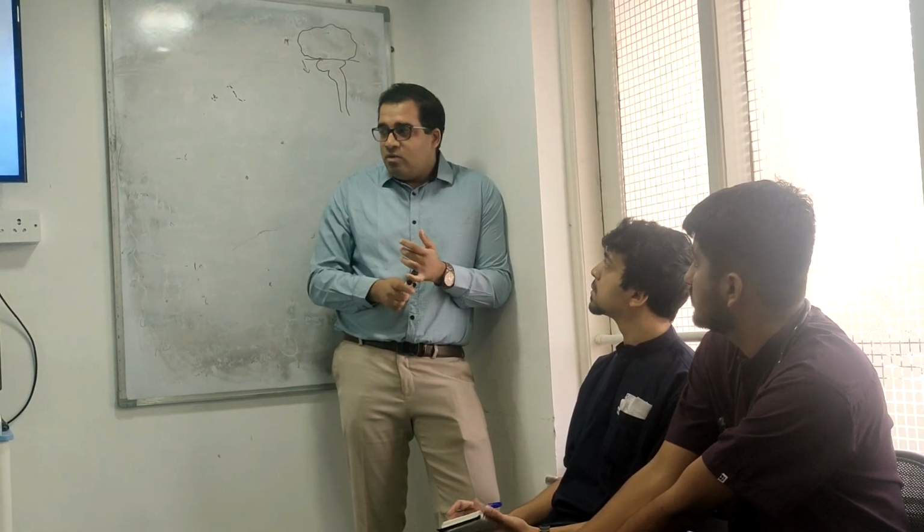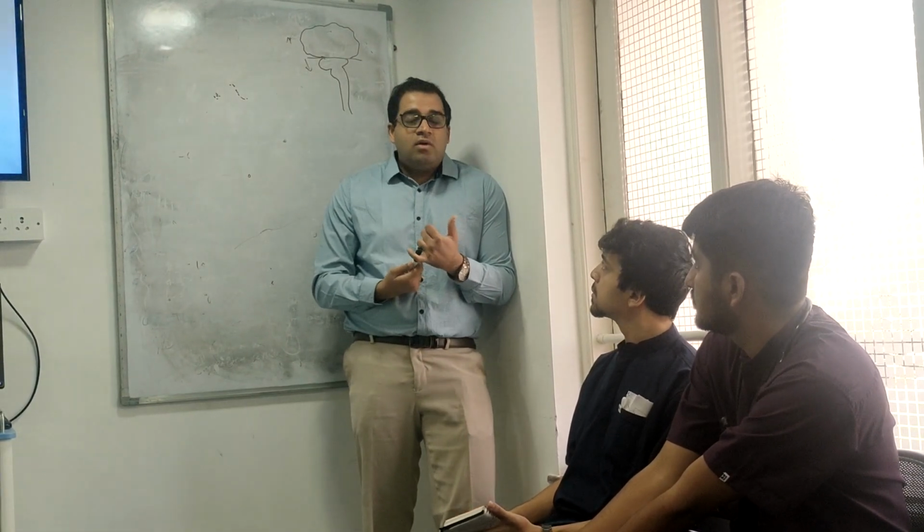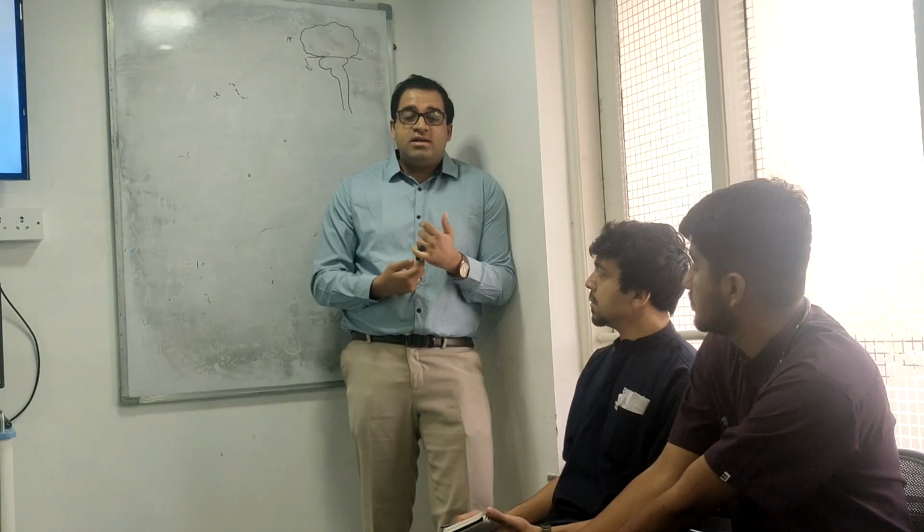BCID, now BCID2 panel. Basically, everything is BioFire. You send a swab, in 1 hour you have a report for upper respiratory, for a stool in 2 hours you have for a lower GI. For CSF you have in 1 hour. So blood के लिए भी है. Unfortunately, something which is not available here as of now, but blood के लिए भी एक panel है called BCID2.